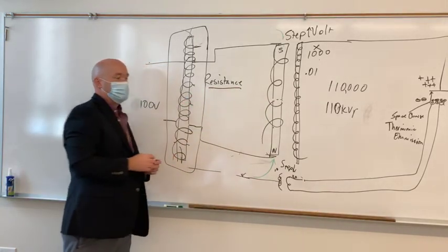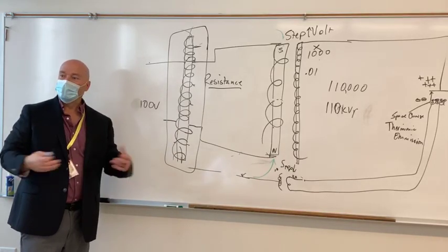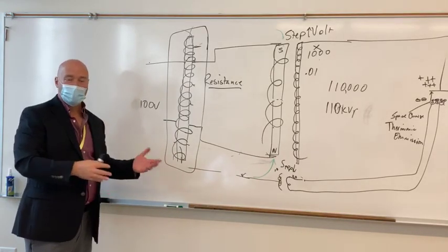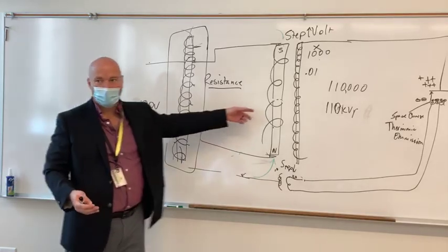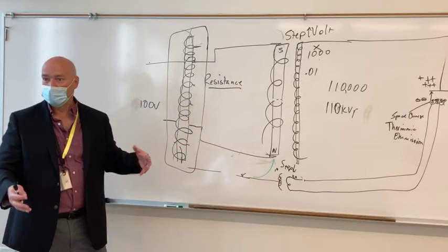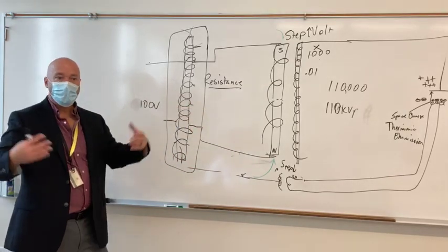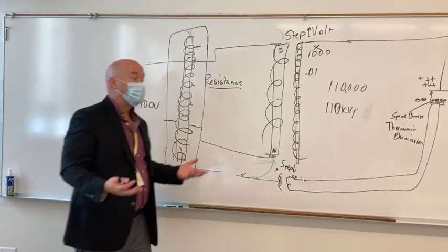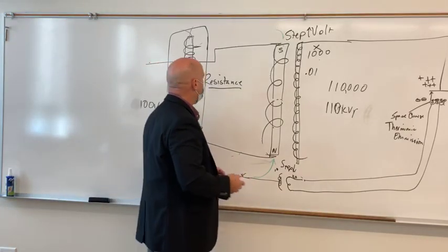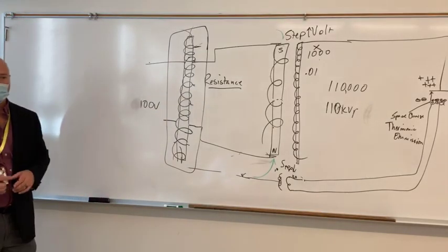Does it reduce all the resistance? Oh, did I call it a superconductor? No, even a superconductor still has resistance. It's just very low. That's not a superconductor, it's an electromagnet. Electromagnets can be superconductors. That doesn't happen here, all right? That's MRI with liquid helium, not hydrogen, liquid helium. We still have resistance, so we're going to lose some due to resistance.